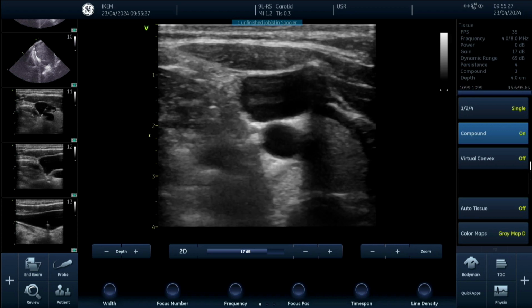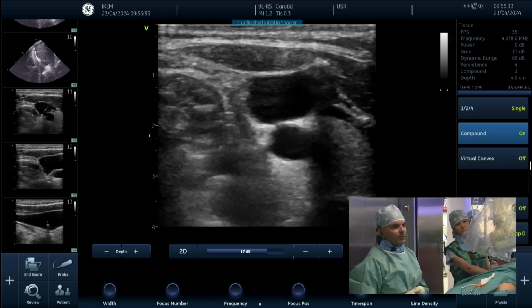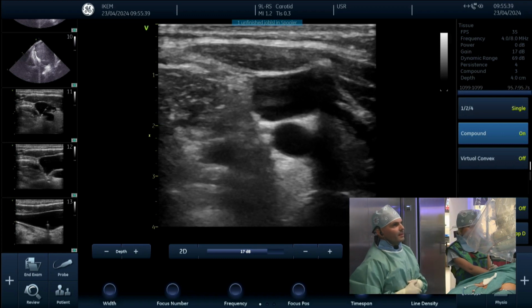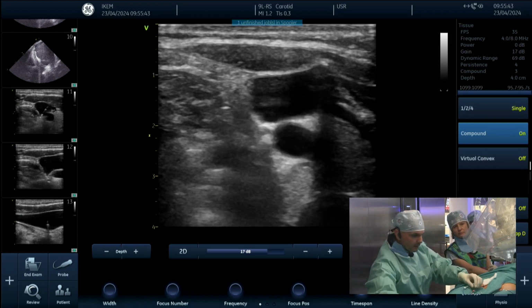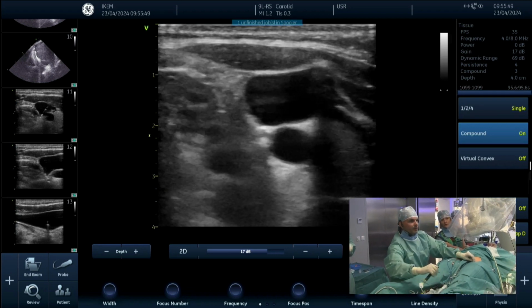So Predrag placed the catheter in the place where the catheter was very close to the vagus nerve, and pacing from that, ECVS showed an excellent vagal response. Can we show the catheter on the ultrasound? Visualize the catheter on the vagus nerve.